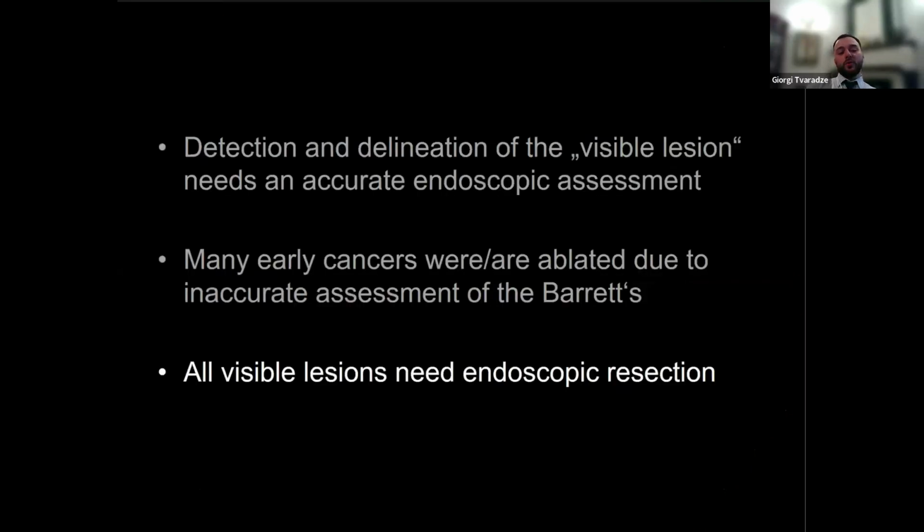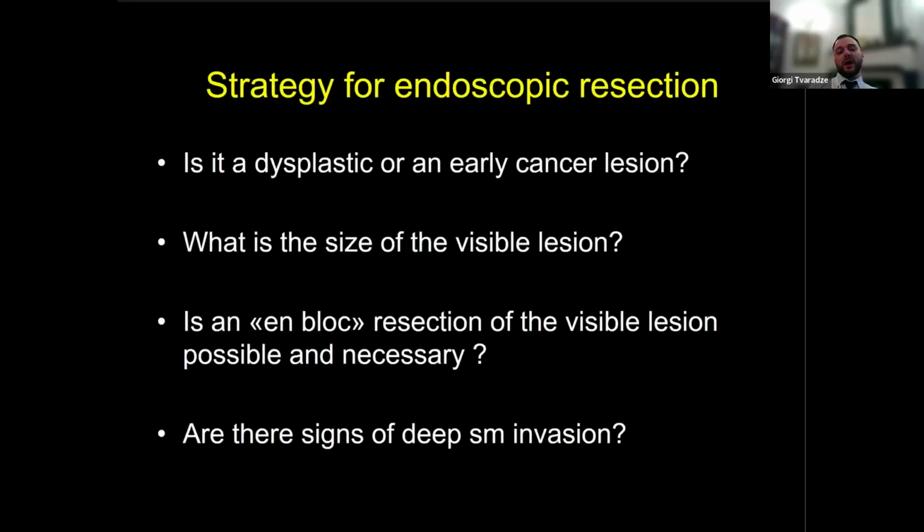And again, all visible lesions need endoscopic resection. Now let me talk about the techniques. We usually use EMR and ESD. Before you use EMR or ESD, you have to answer several questions.